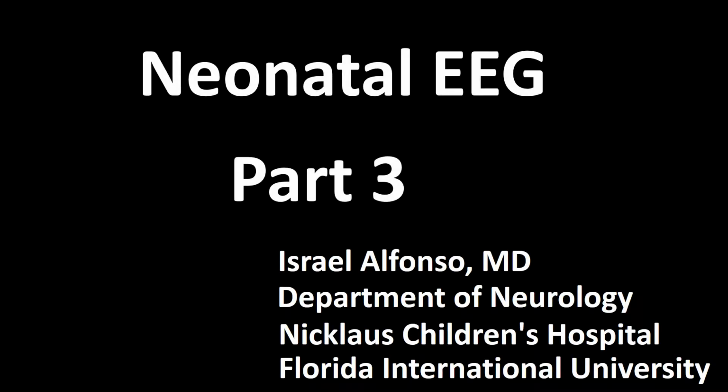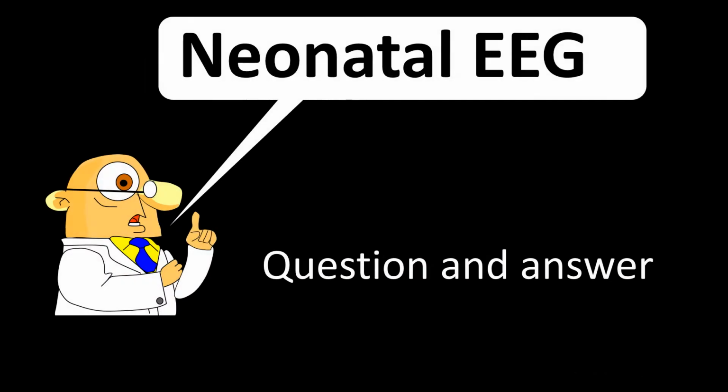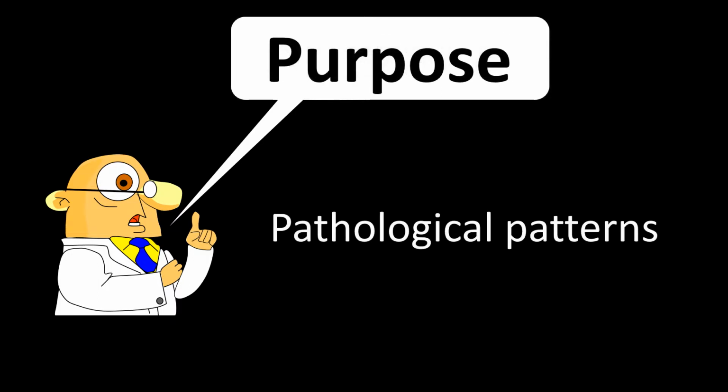This is the third part of a three-part series on neonatal EEG. It is intended for the Nicklaus Children's Hospital Clinical Neurophysiology Fellows. It will be conducted in a question and answer format. During it, I will talk to you about pathological EEG patterns that occurred in the neonatal period.